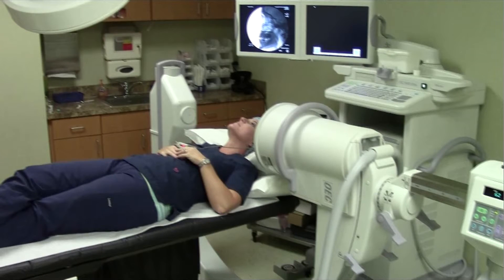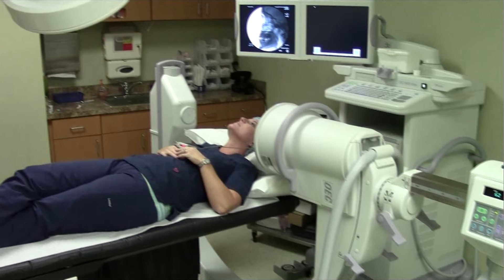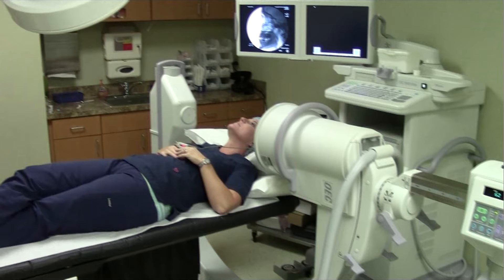I'm going to introduce you to a technique to perform a sphenopalatine ganglion block. This is a treatment that has been used for decades, but it is now safer, simpler, and more comfortable for the patient. This is a 38-year-old female who has a 10-year history of chronic recurrent migraine headaches.